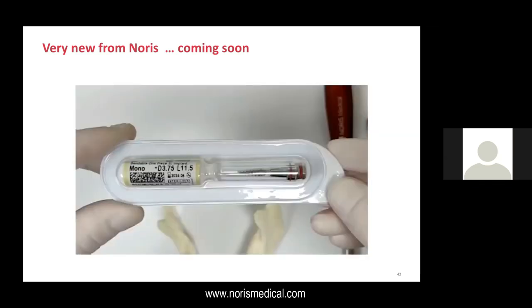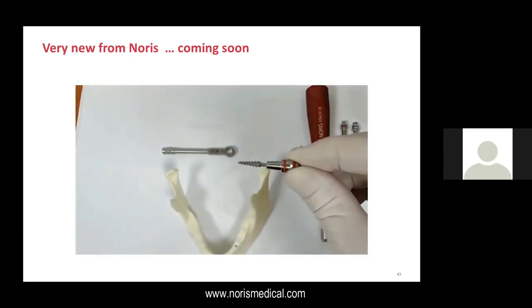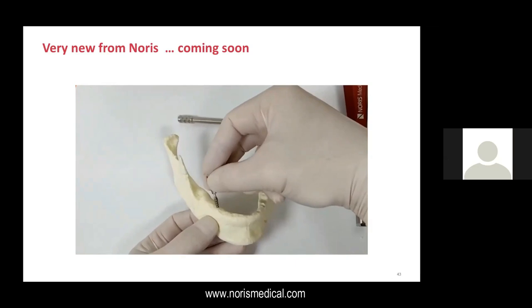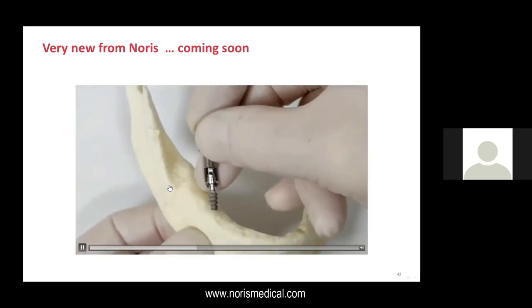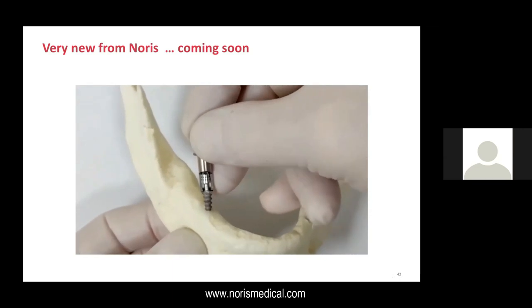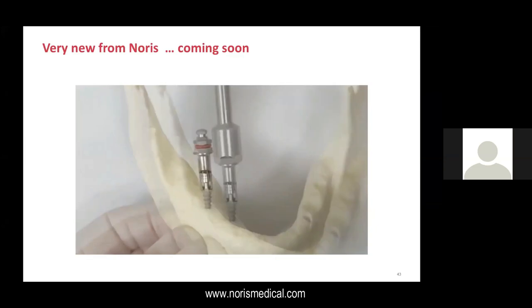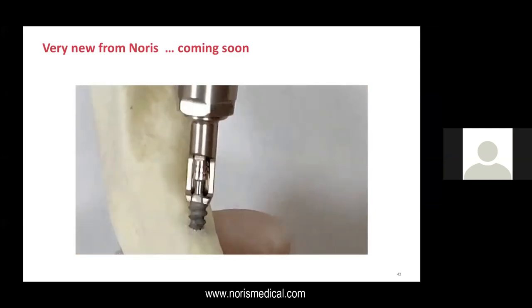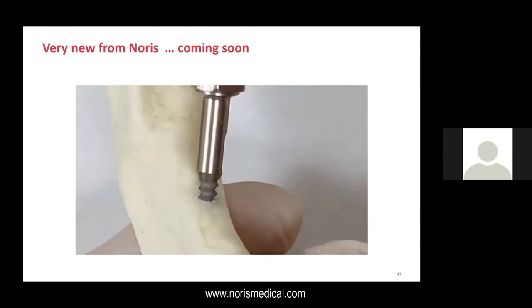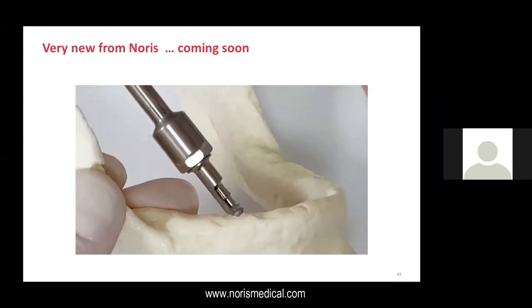This is actually a movie that was done especially for me by Mr. Rami Ziv, the head of the company previous. Here, as you can see, the new key actually holds the abutment and the hex in the implant.